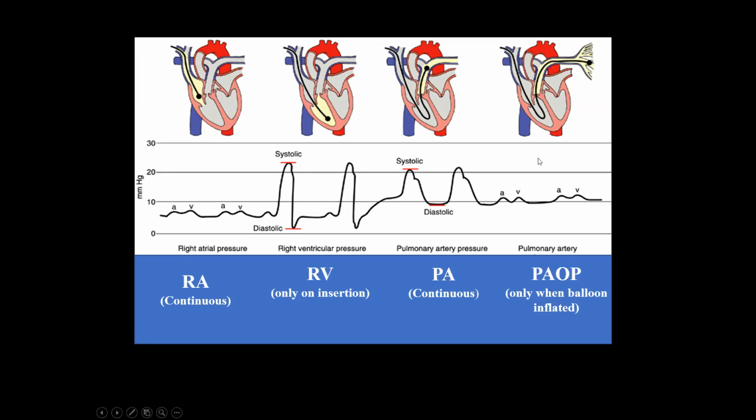If you see this waveform and you haven't touched the catheter, something's wrong. As you walk into the room, the only waveforms you should see continuously are written down right here. So if I see this or this, I've got to troubleshoot. That's an emergency. This one's more of an emergency than this one. No, actually, they both are.